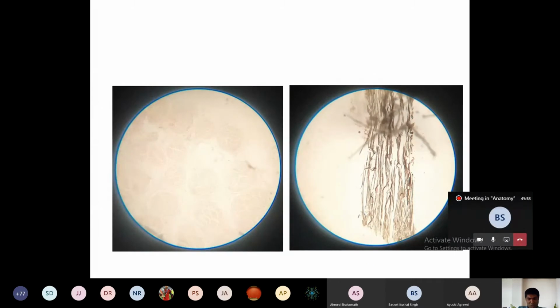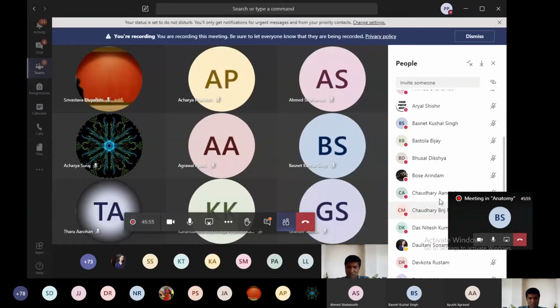Yes. Now coming to the end of the slides. I don't know how many slides are left, still more. So I'll only discuss if time permits. You identify at first, then I'll give you the chance to identify in the class only. If not, you also have to work it out by yourself.